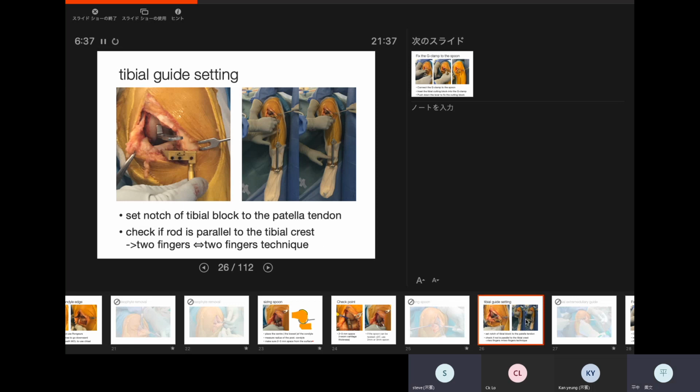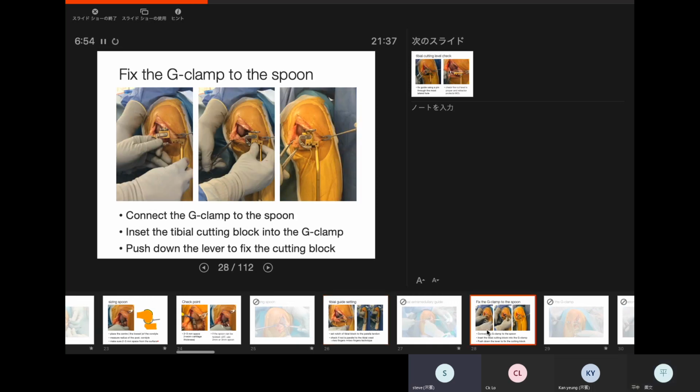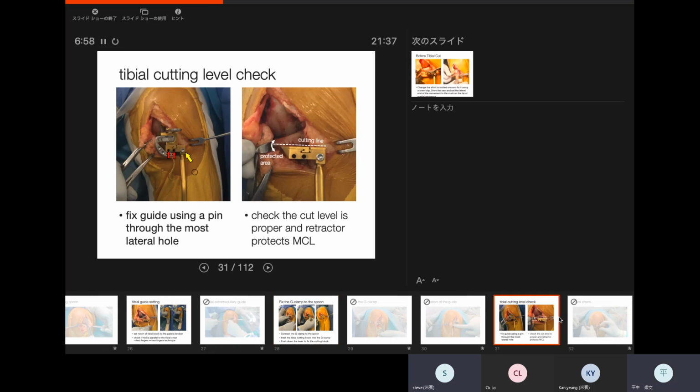Then set the tibia guide. The tibia guide should be parallel to the anterior tibial crest, and connect the tibia cutting block using the G clamp. Then clamp and fix the cut block, but never use the two medial holes to hold because it can cause a fracture in the future. Please use the most lateral hole. The upper surface of the cutting block is the cutting surface of the horizontal cut. Please make sure the cutting line comes to the center of the protector that protects the MCL.